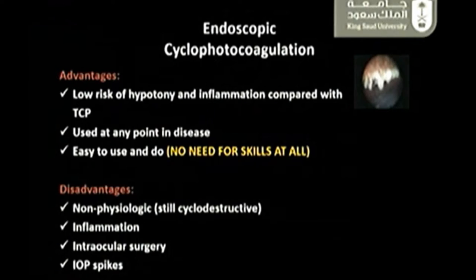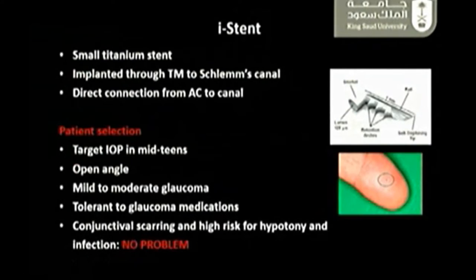The disadvantages: it's non-physiologic, still cyclodestructive, it can induce inflammation, it's an intraocular surgery, and it can induce IOP spikes, so be careful with patients with total cupping or very advanced disease. We'll go over this very fast.